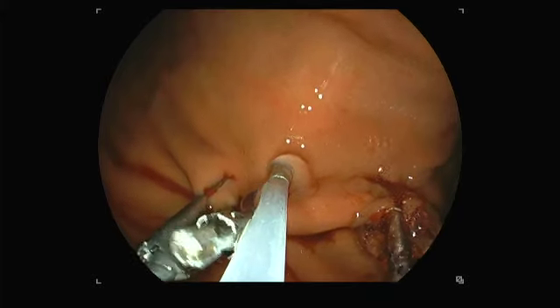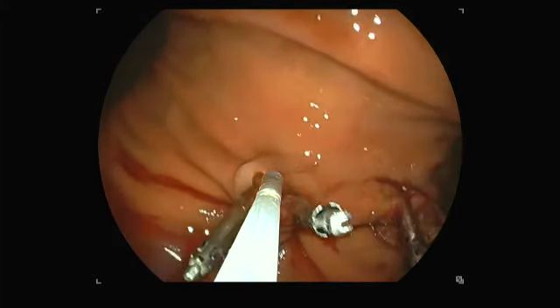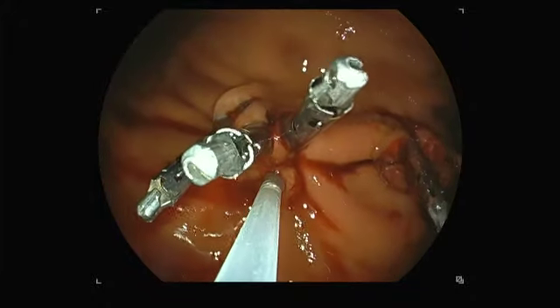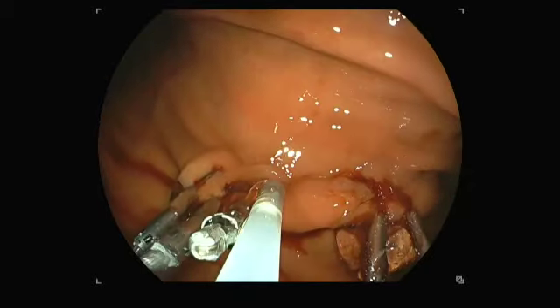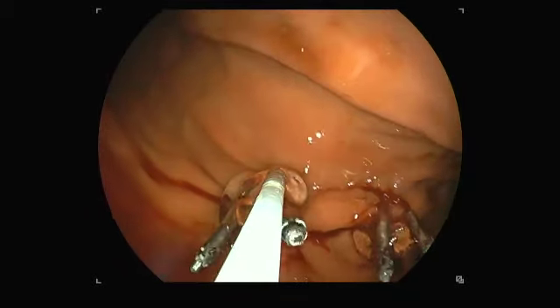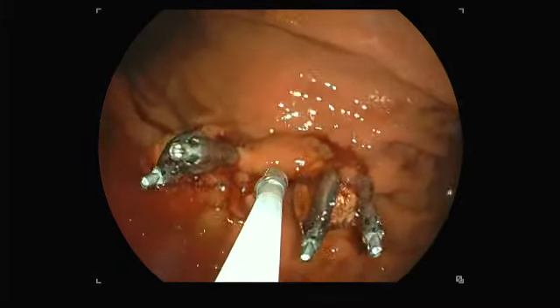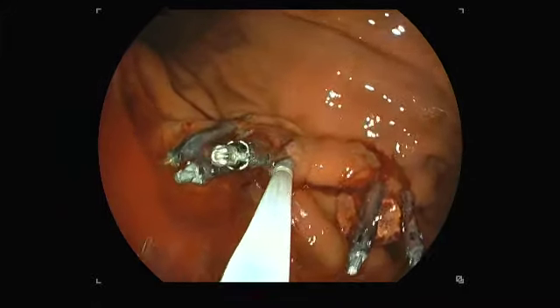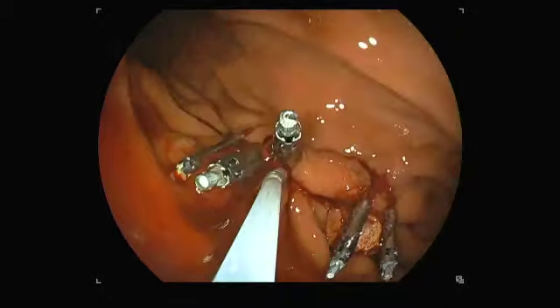I'm very pleased to share with you that this intervention has stopped the bleeding and the patient's hemoglobin remained stable. He did not require any excessive amount of transfusions, except for that required for management of leukemia, and is currently undergoing therapy for his leukemia.